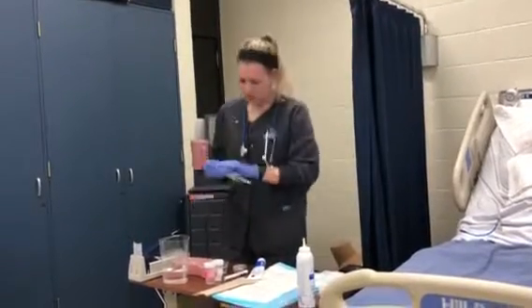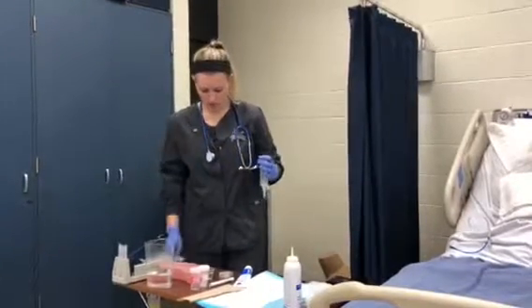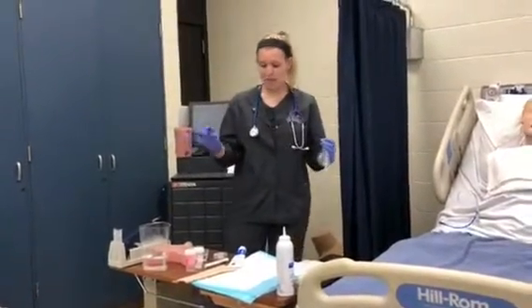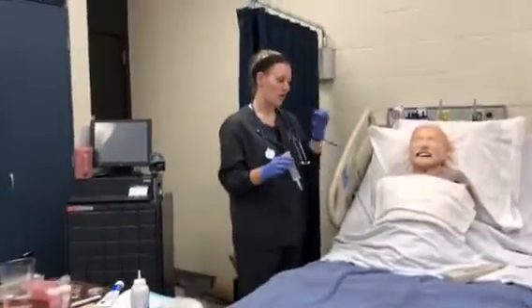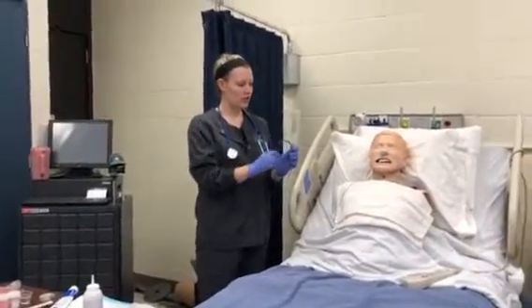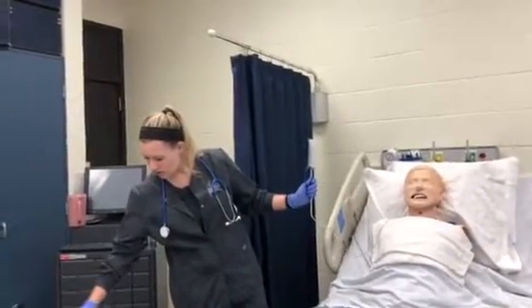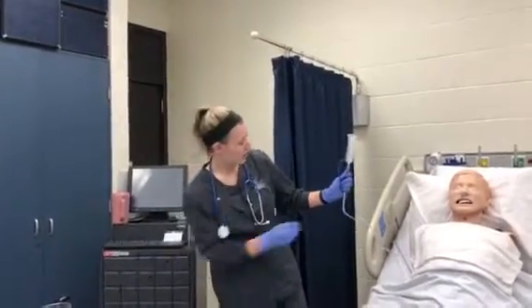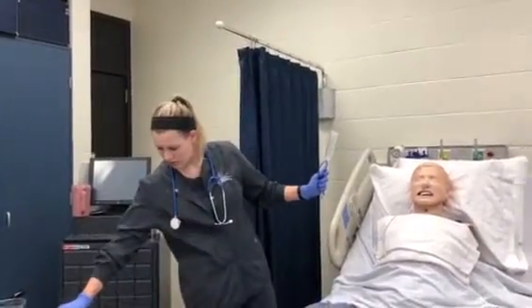And actually, since I have them in these cups already, I'm just going to take this part out. This is a little bit of an easier way. I've already crushed my meds and got them all ready for the purpose of the demonstration, just because it's a little bit harder for them to dissolve. We want to make sure that this is attached, and so we're going to do our meds now. Make sure that you're clamping it off too, so that nothing's running back at you.